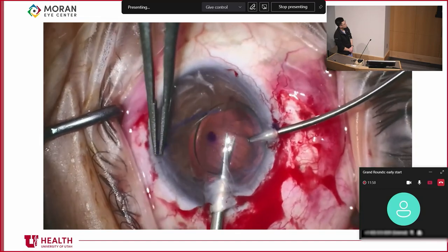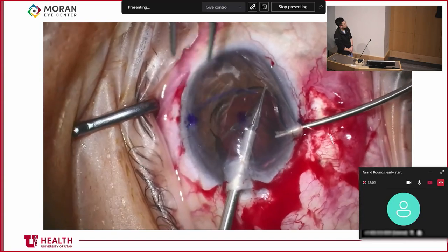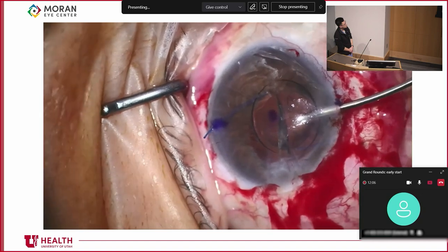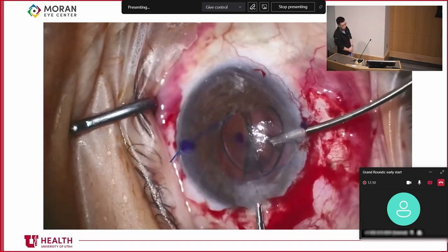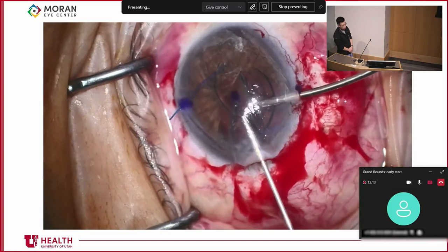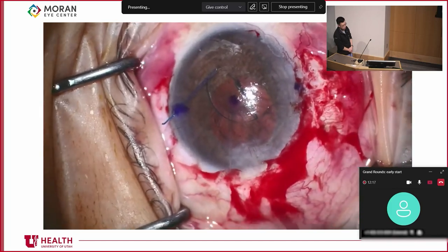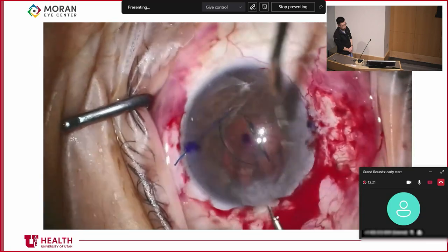And then we go cut, cut, cut with our intraocular lens scissors, and we have two pieces, which are much easier to remove from the eye. A little tip when removing the lens piece: grab it from the section where the IOL optic-haptic junction is facing towards the wound instead of away, or it'll get stuck in the wound.